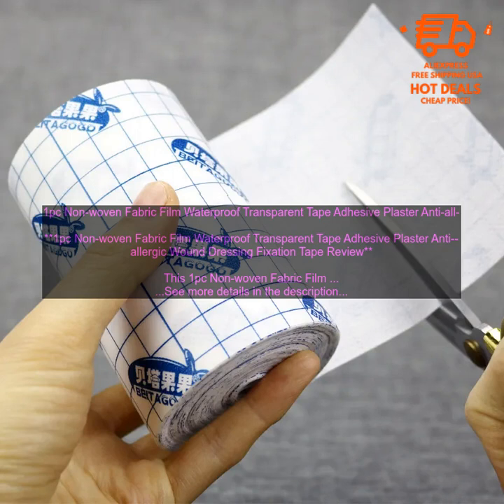Q: How do I apply this tape? A: To apply this tape, clean the wound thoroughly, cut the tape to the desired size, apply the tape to the wound, and make sure that it is secure. Q: How often do I need to change this tape? A: You should change the tape as needed.